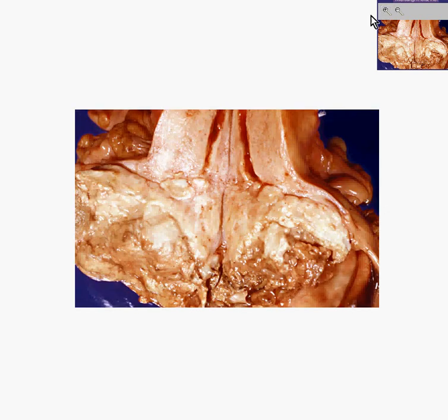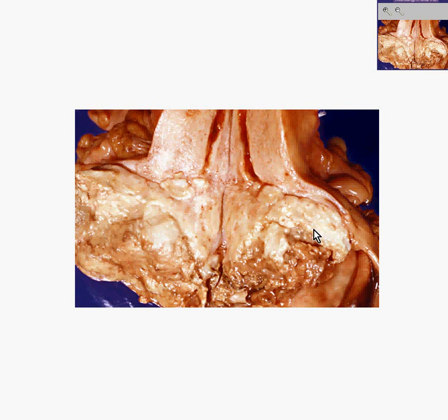What we have here is a uterus that has been cut longitudinally. Here is the endocervix, and perhaps the fundus would be above our field of view. The lower endocervix extending to the vagina is this large tumor, which has whiter areas perhaps representing more fibrous tissue, as well as more irregular hemorrhagic and yellowish areas perhaps representing necrosis and hemorrhage. This is a large infiltrating squamous cell carcinoma of the cervix.